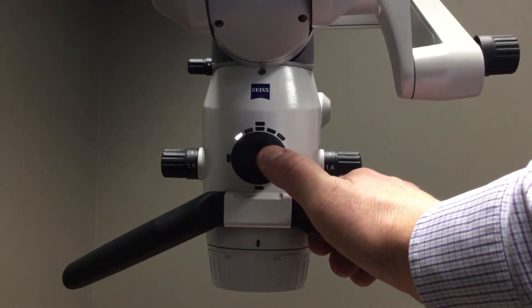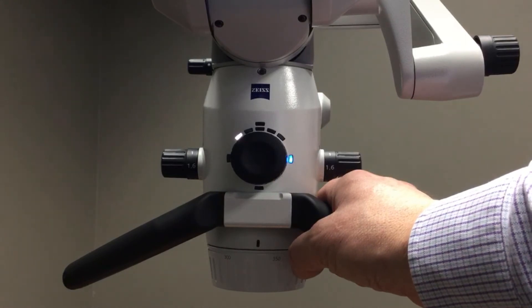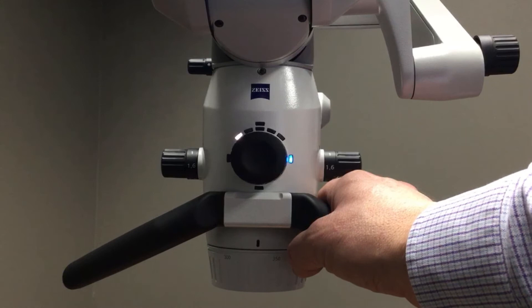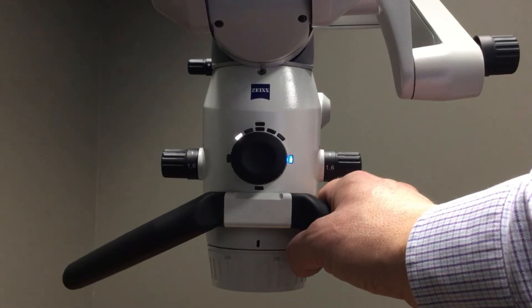If I tap the wheel in the three o'clock position, this is my true light function. True light is a composite filter so it extends the working time of your composites.